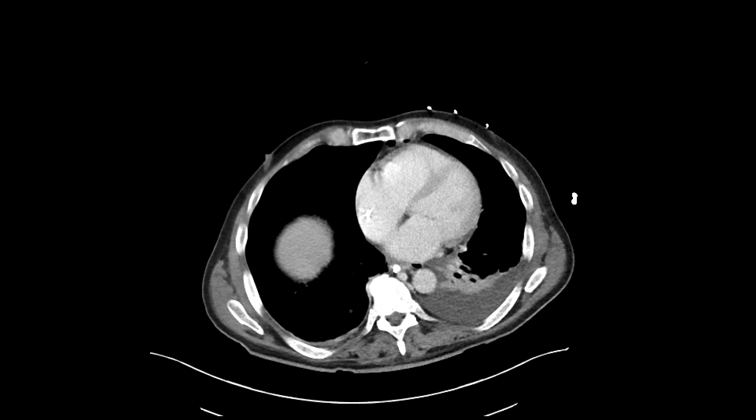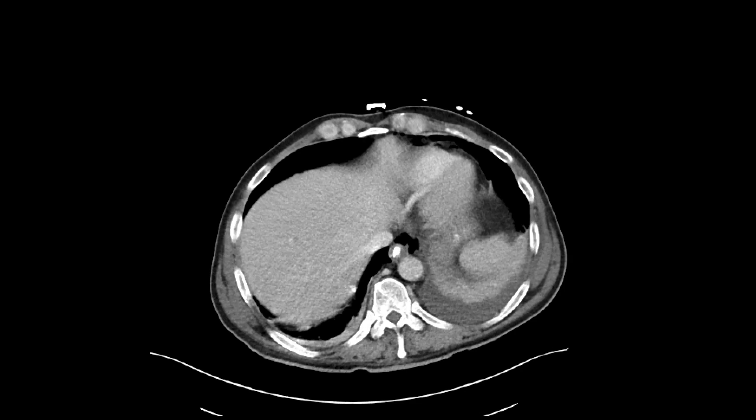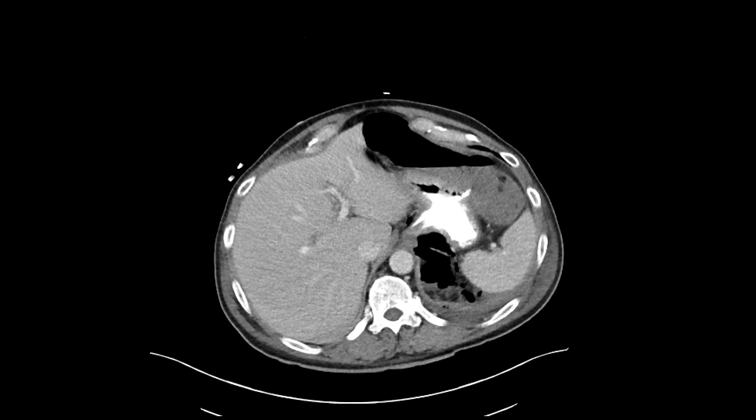This is a patient who had a bladder cancer that was quite adherent to the sigmoid colon. The patient ended up getting a cystectomy with an ileal conduit creation and a sigmoidectomy as well. Post-op, the patient wasn't doing so well, so got a CAT scan with intravenous contrast.